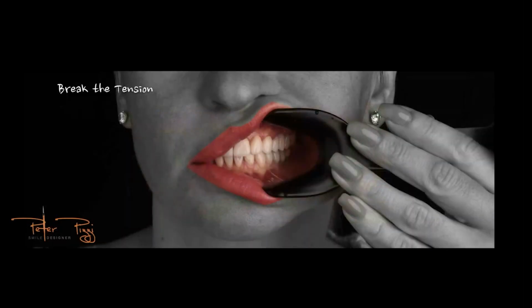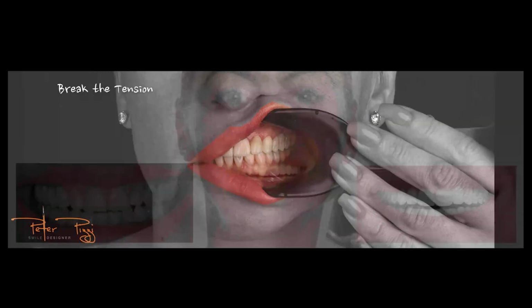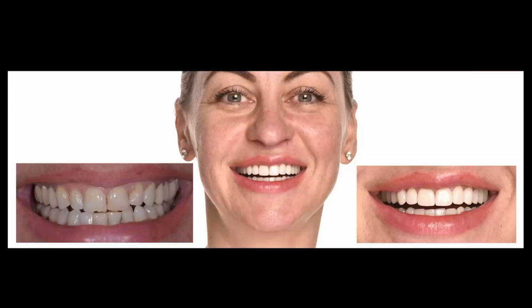So the first step is for me to do exactly what I said. I want to kind of lengthen that tooth and get it down and try to get a little more pink to surround it. And that's really the first focus for breaking that tension. After that, I'm going to come back and try to work through the contralateral side and maybe create a little more tension. How? By maybe rotating this lateral out a hair more, shortening it a hair more. So at least when we look at the smile, it kind of balances out a little bit more, and we don't get that distraction of something being off.